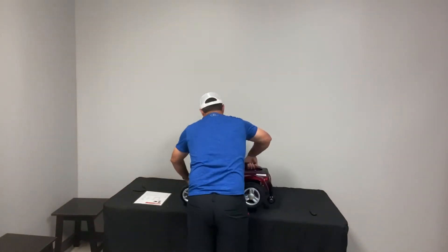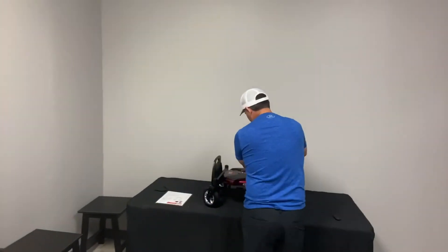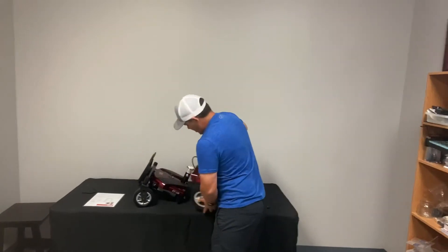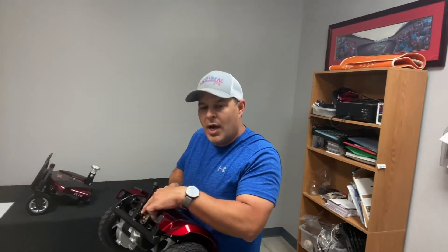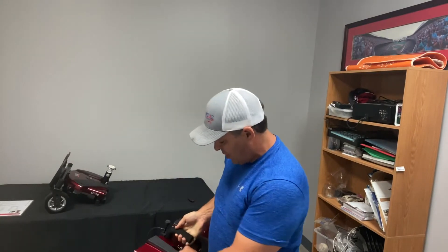There is a button right here, and all you have to do is push this button and that disassembles it. There's a button right there — you press down and that releases the connection. It also has a handle here, which is really nice.